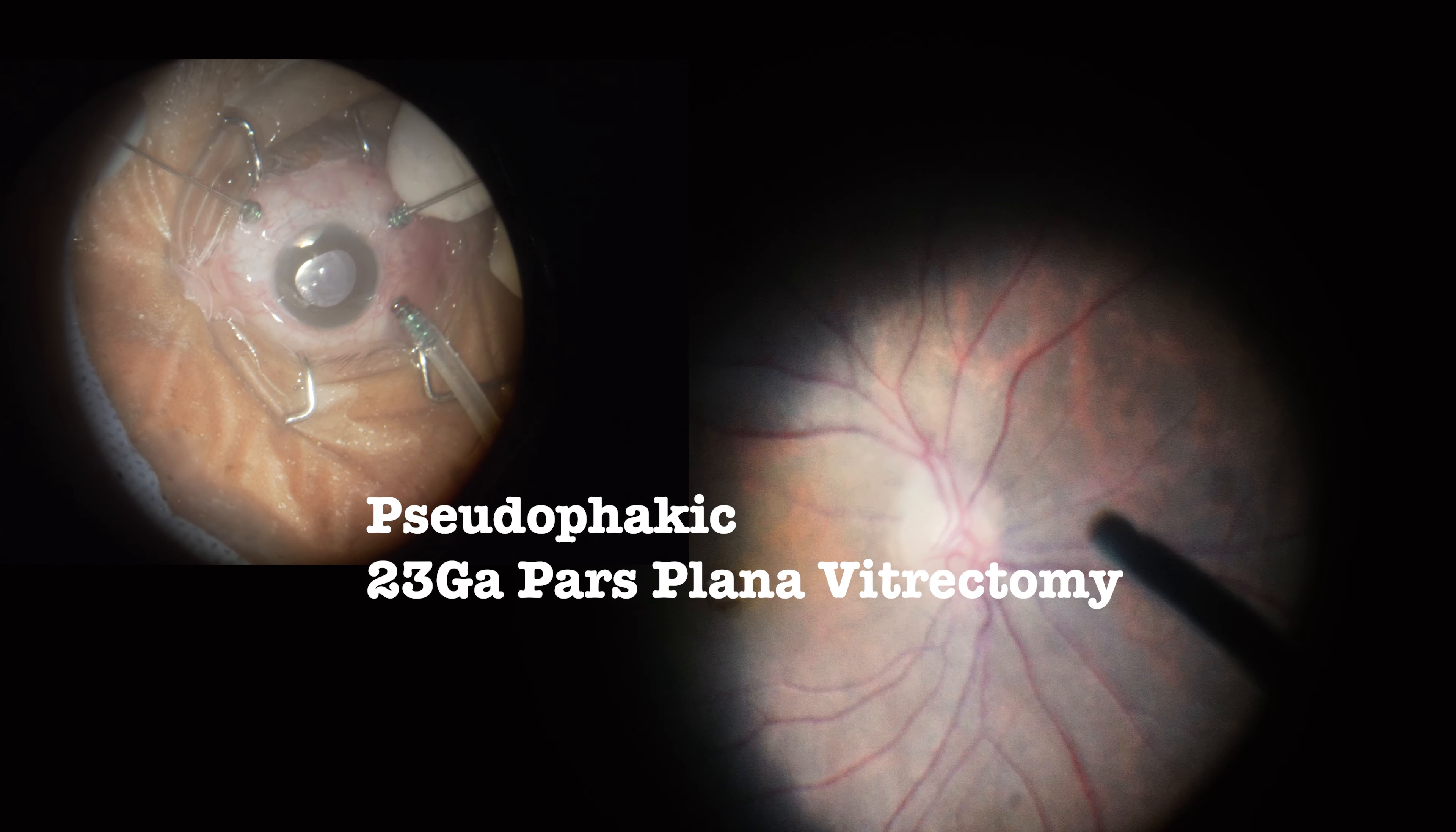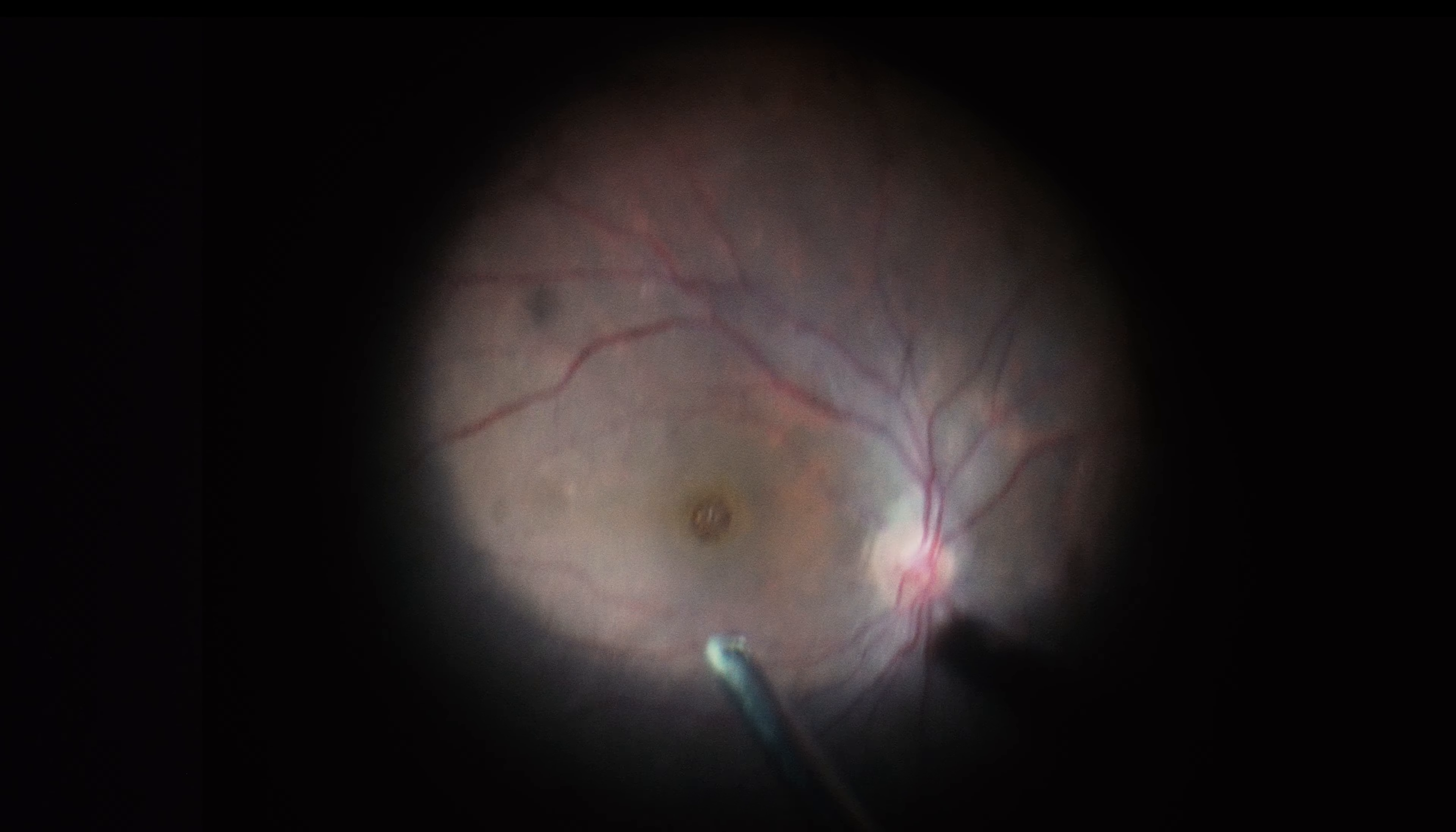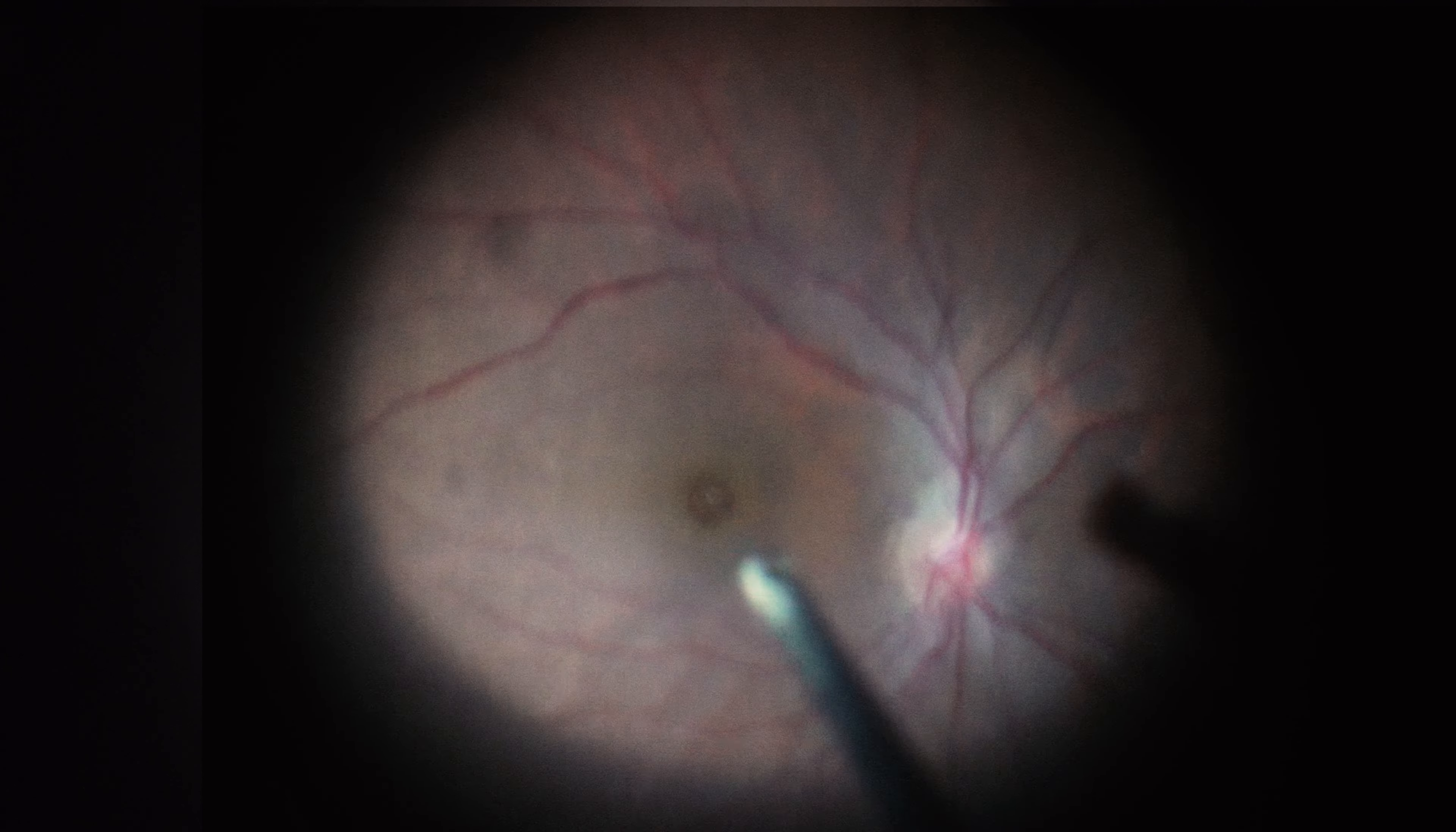Unfortunately, the surgery was scheduled for May 2023. The 23-gauge pars plana vitrectomy was carried out.